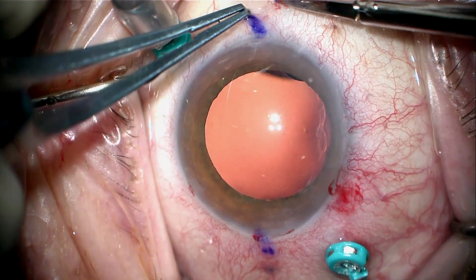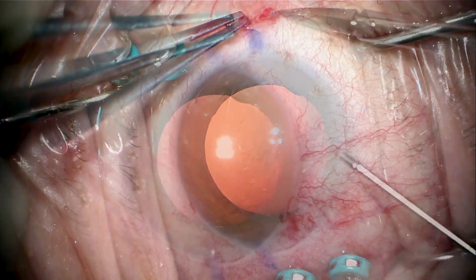This is a big eye — a 28 millimeter eye — which makes it a little bit more challenging.